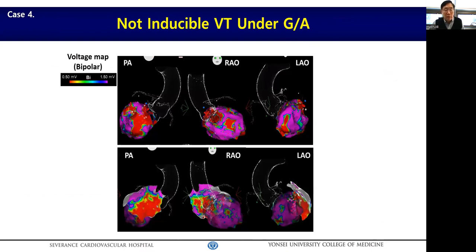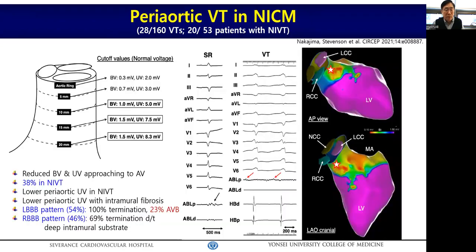We carefully conducted endo and epi-map, and unfortunately, we could not induce clinical VT at all. The patient was under general gas anesthesia, which could suppress VT induction, and also substrate map could suppress clinical VT. Therefore, we had no choice and conducted the endocardial ablation at the LV outflow tract scar area. We finished the case after confirming no further induction of VT with an aggressive pacing protocol.